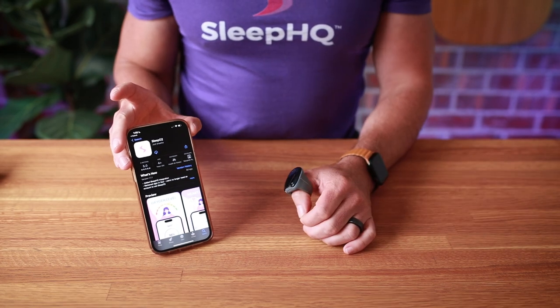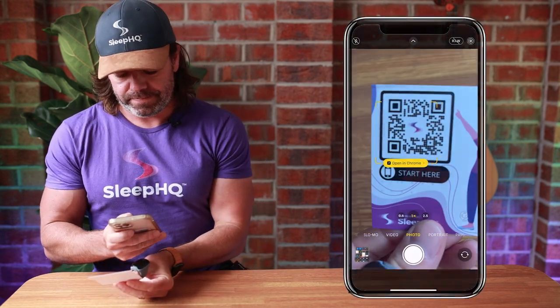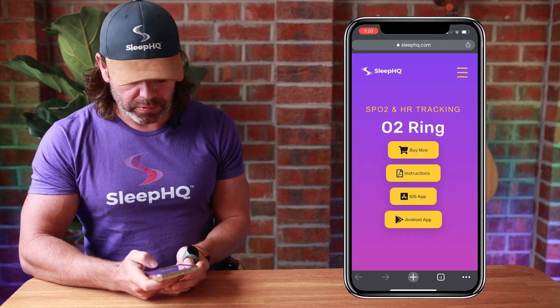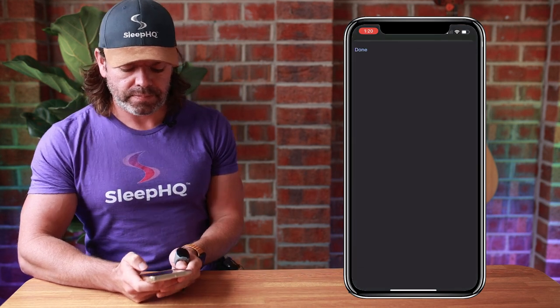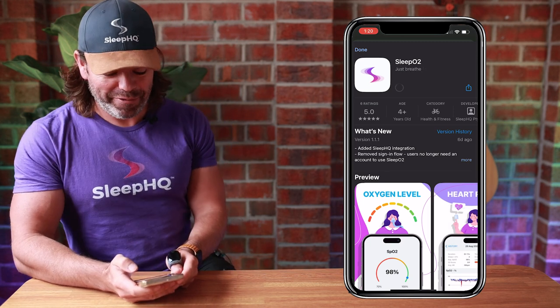Now we'll connect the O2 ring via Bluetooth to our brand new SleepO2 app. To start, scan the QR code. Because I'm using an iPhone I'll choose the iOS app — if you're using an Android phone, you'll choose the Android app. You can then download the SleepO2 app to your phone.